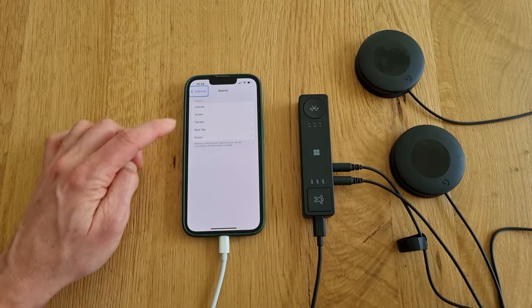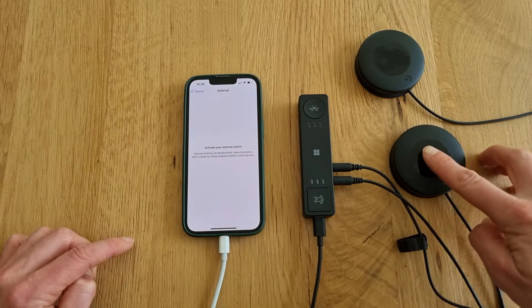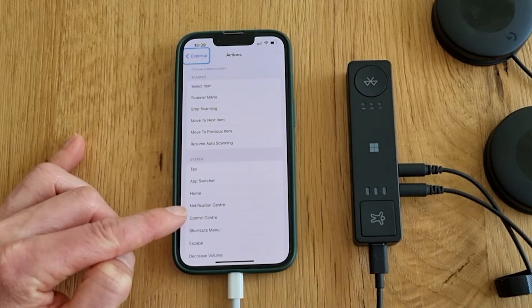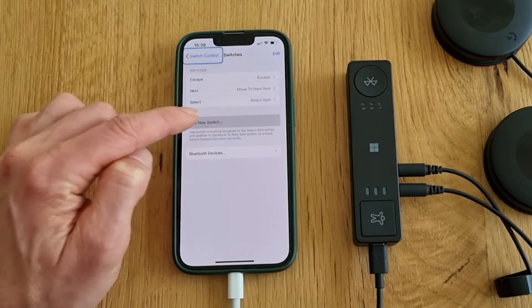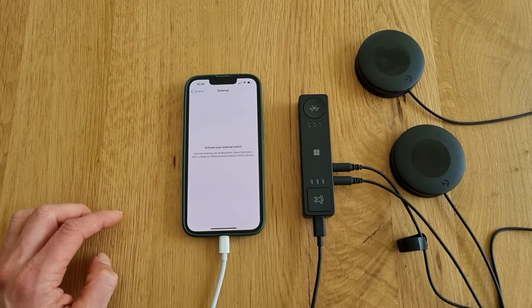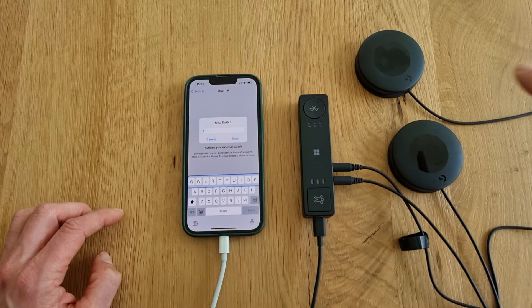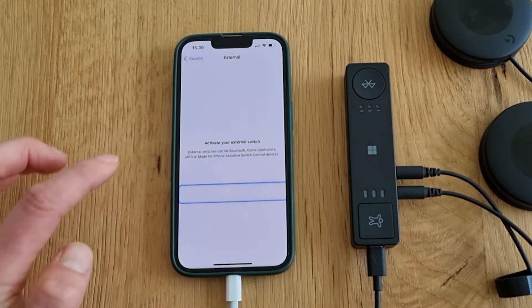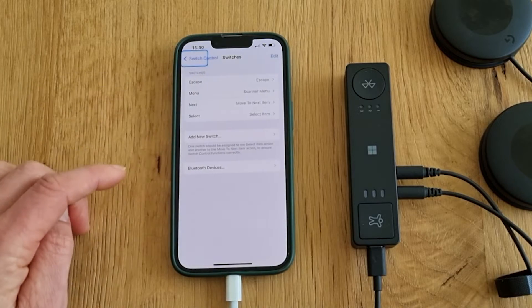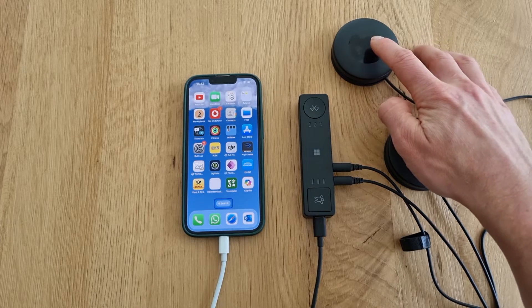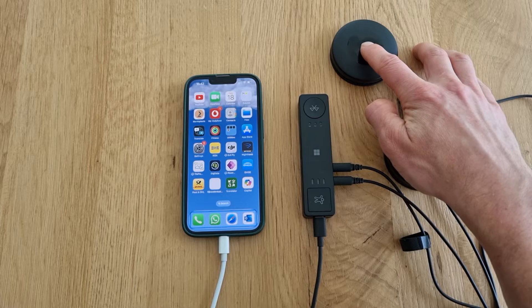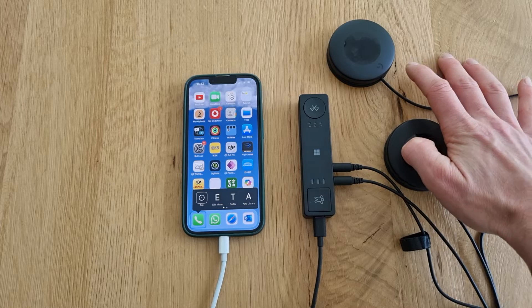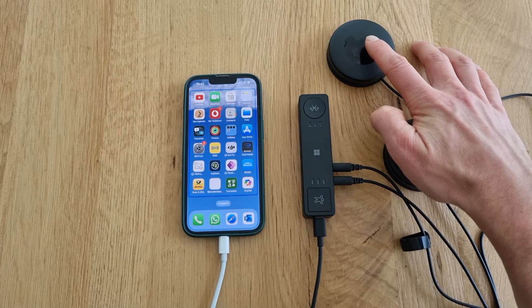Next I'll go and add functionality for the second switch I have, and I'll add the Escape functionality to it. Finally, for this setup with two switches, let's add a long press functionality for the second switch as well — in this case the functionality to open the Scanner menu. So now we have a simple navigation setup for your iPhone, but quite obviously there's a vast variety of different ways to set this up, especially if you have the ability to use more switches.